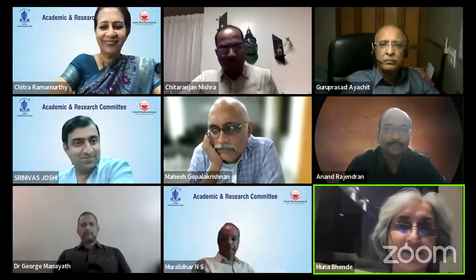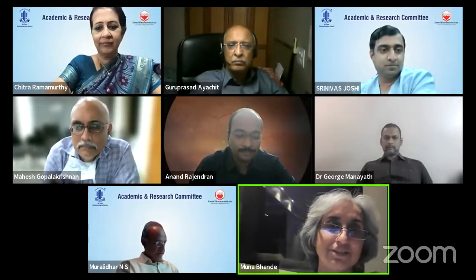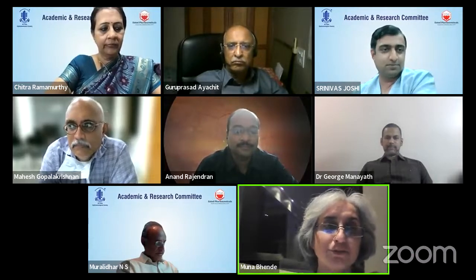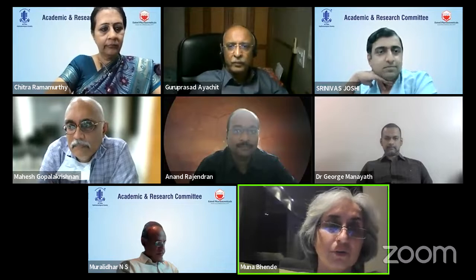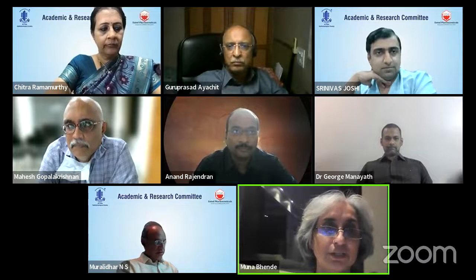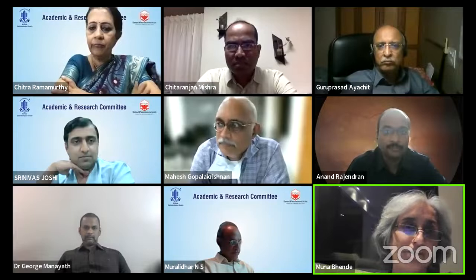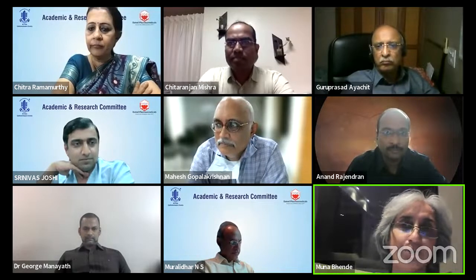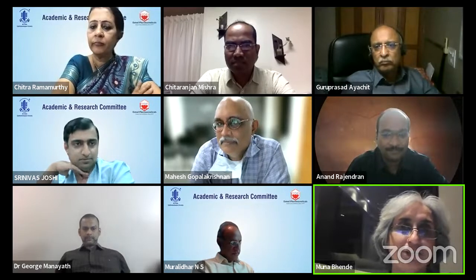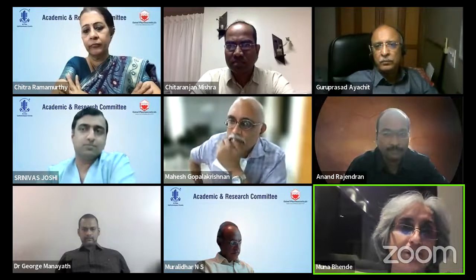Thank you, Mahesh. That was a very nice demonstration of the ICG changes in PCV. I would request you to explain to the audience how often you would repeat an ICG, since you've confined yourself to ICG. And in the post-PDT era, where we know the BVN does not disappear with anti-VEGF treatment, what are the ICG features that tell you that the patient is responding?